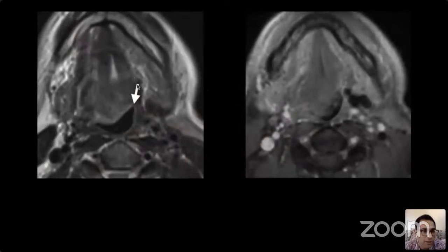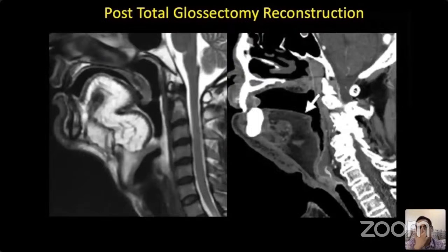Usually after partial resection, you see that there's retraction, there's loss of muscle mass. This is a normal case. After surgery, you see that there is loss of the bulk on the operated side, and there's retraction of the tonsillolingual sulcus. This retracted tonsillolingual sulcus may at times enhance and should not be considered as recurrent disease.